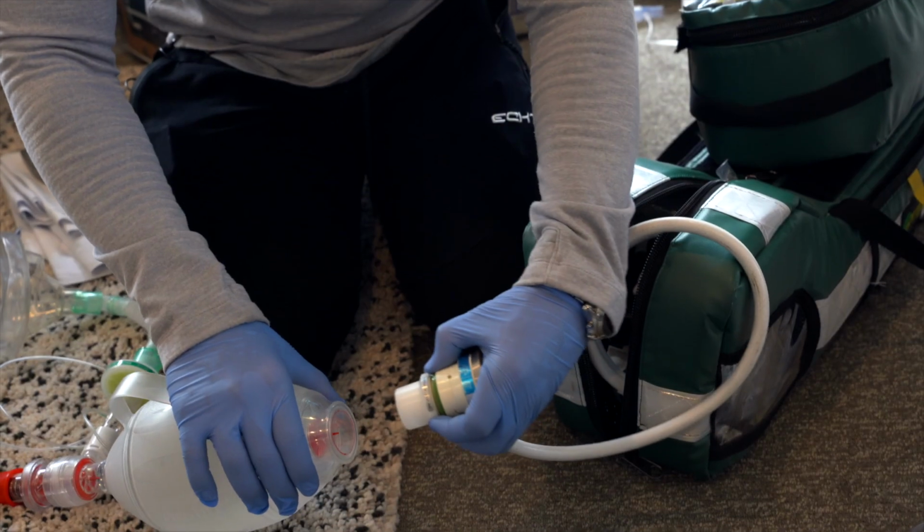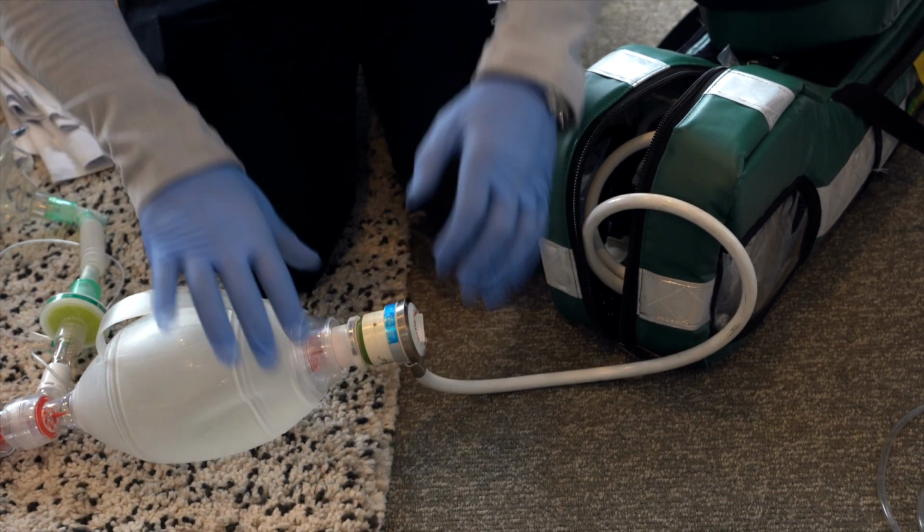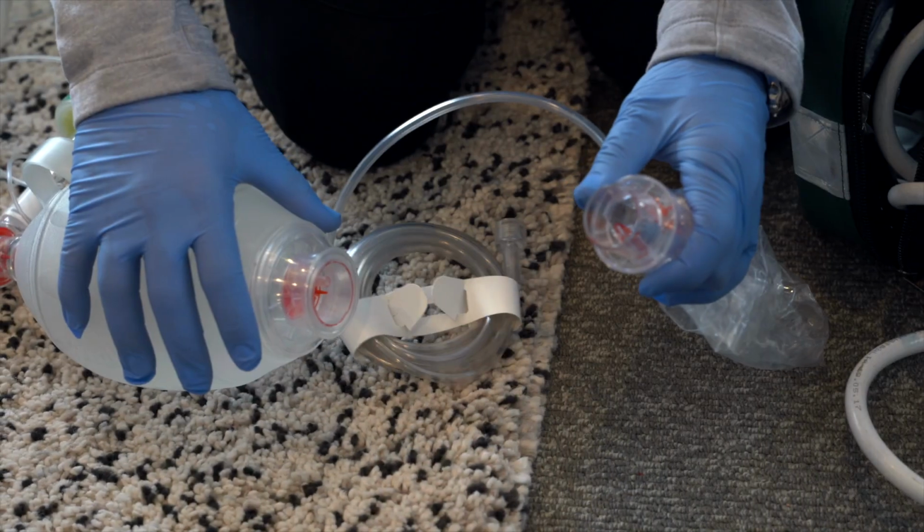In Ambulance Victoria, we currently use the AmbuSpUR 2 BVM. There are several ways of increasing the oxygen concentration beyond room air using this device. Number 1 is to attach a demand valve which will supply 100% oxygen and prevent room air being entrained into the device. With a good seal, it is technically possible to deliver an FiO2 of 1. Number 2 is to attach the reservoir bag.